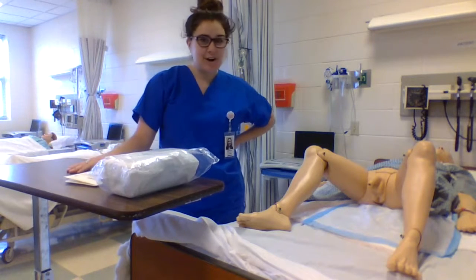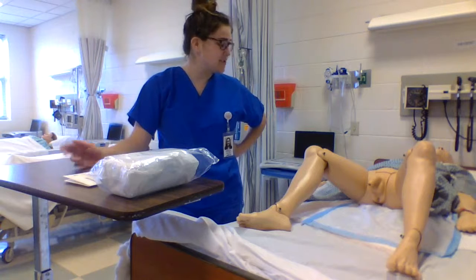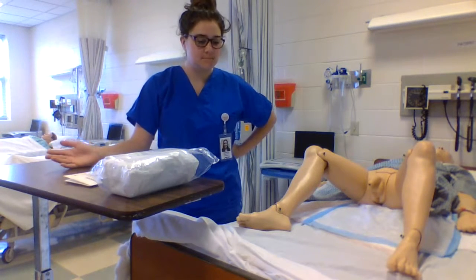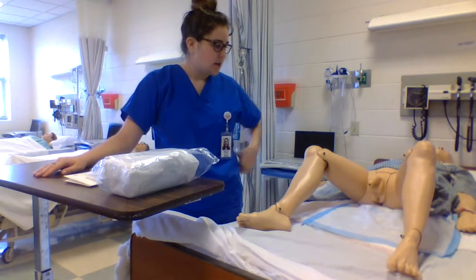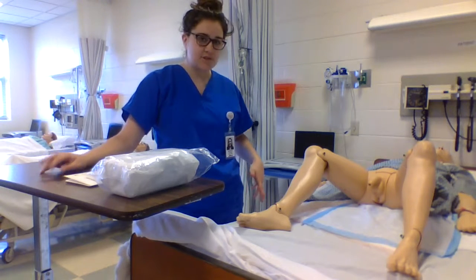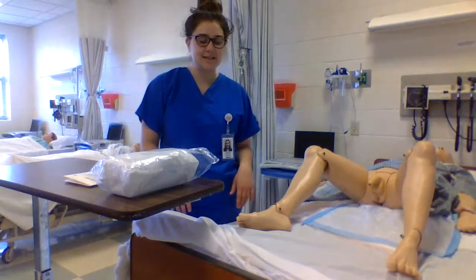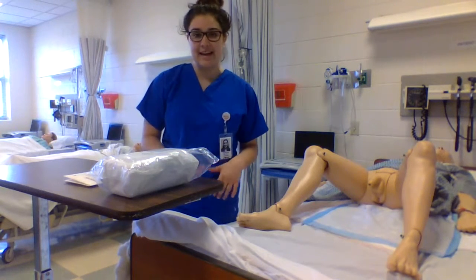Then I'm going to knock before entering the patient's room. I'm going to identify the patient using 2 identifiers. I'm going to note overall condition, explain the procedure, provide for privacy. I'm going to raise the bed for good body mechanics, and then I'm going to put on PPE if indicated.